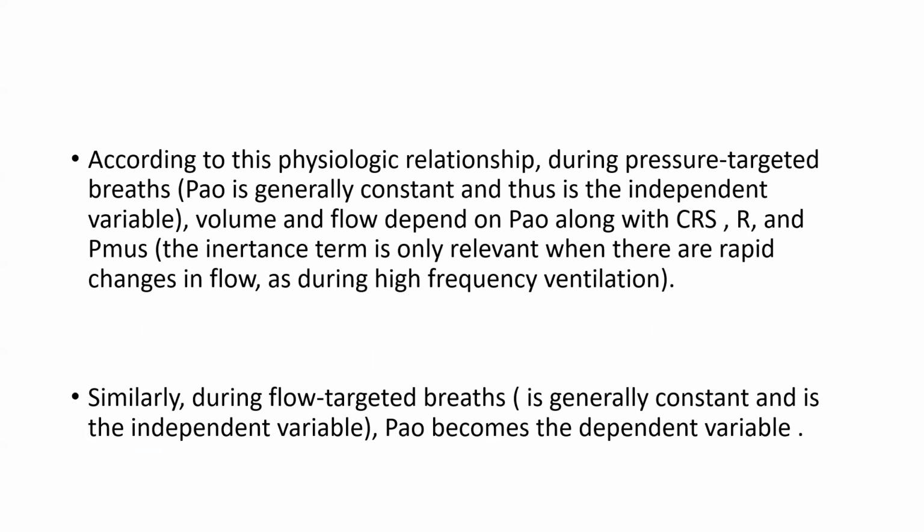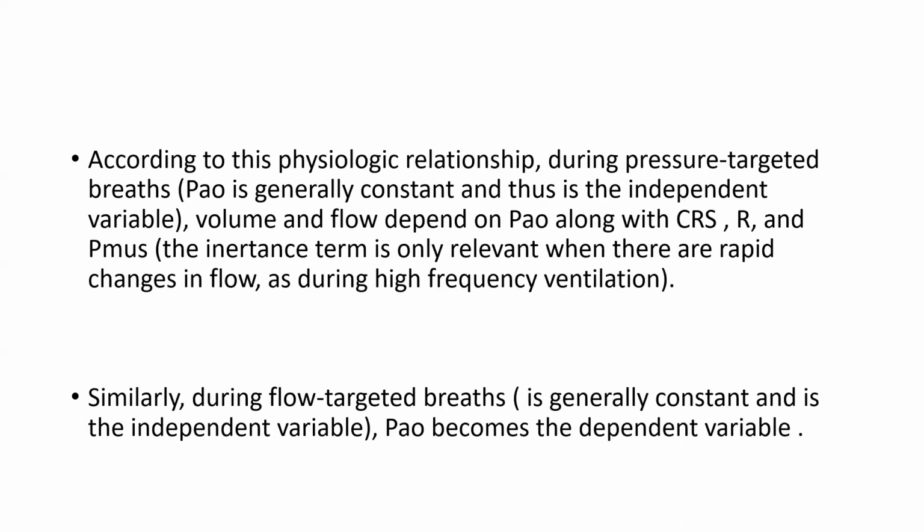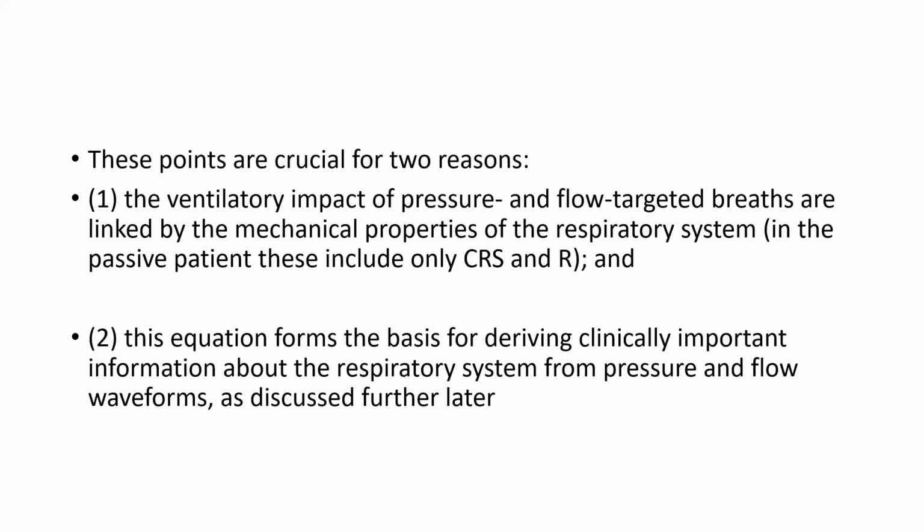According to this physiological relationship, during a pressure targeted breath, volume and flow depend upon the airway opening pressure along with compliance, resistance, and the pressure produced by the inspiratory muscle. Similarly, during a flow targeted breath, the pressure at the airway opening becomes the dependent variable.